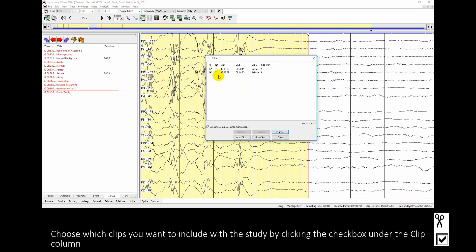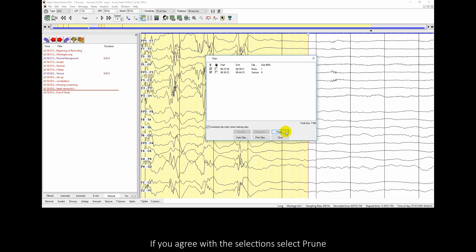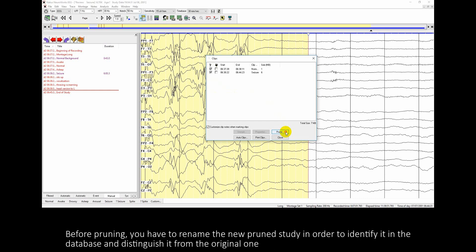Choose which clips you want to include with the study by clicking the check box under the clip column. If you agree with the selections, select Prune. Before pruning, you have to rename the new prune study in order to identify it in the database and distinguish it from the original one.